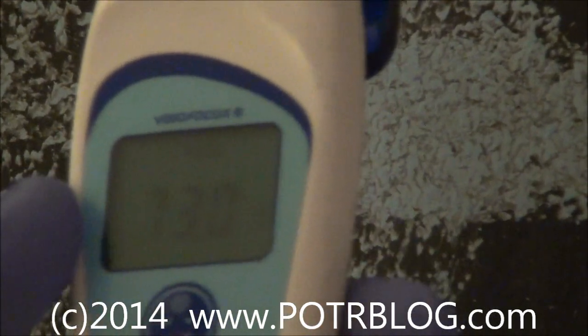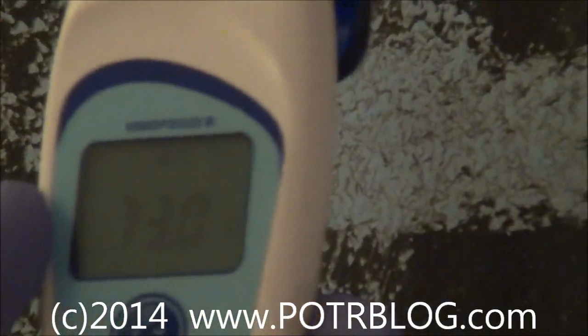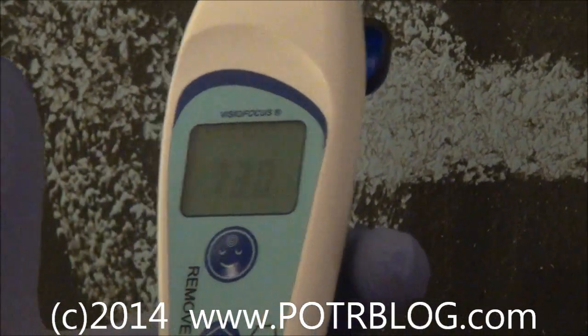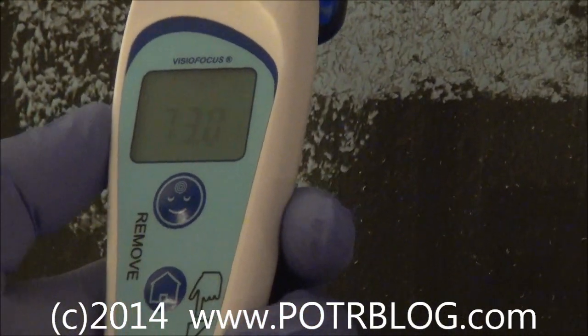It's offsetting the temperature of the skin via a constant to back-calculate what the internal temperature is. It lets you choose from three different internal temperatures: oral, anal, and axial. You can also adjust it between centigrade and Fahrenheit.